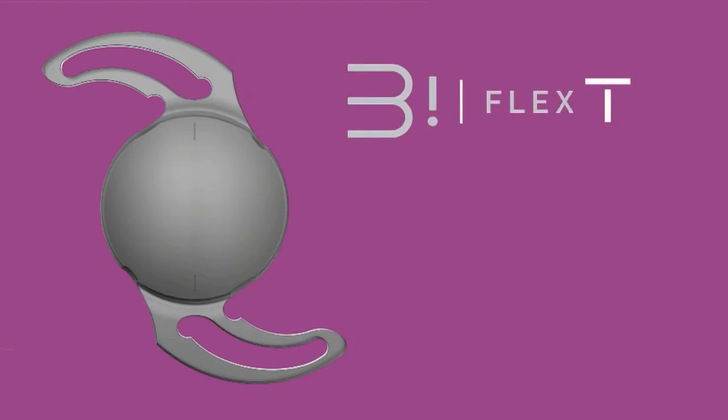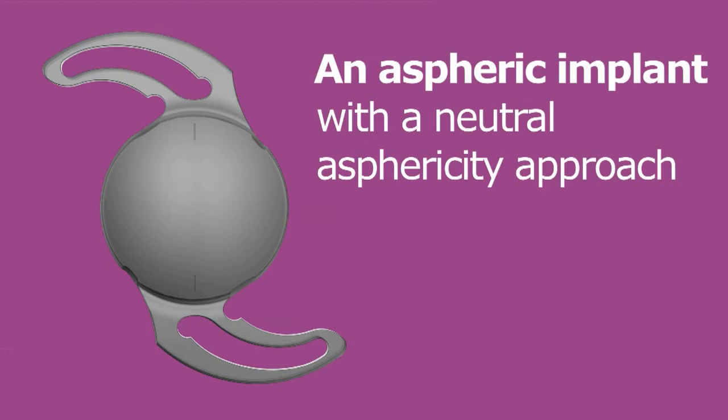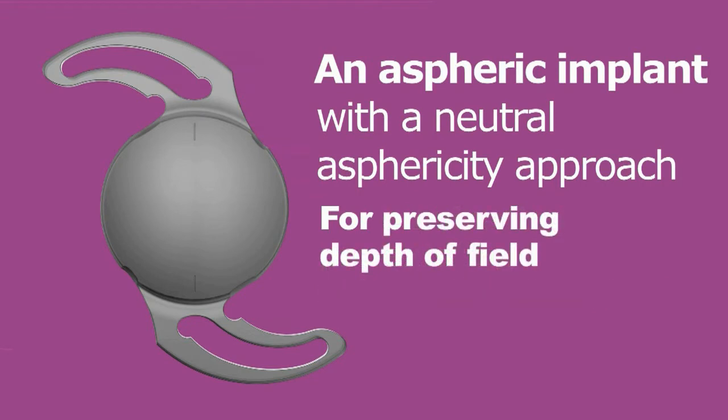In addition to an excellent toric correction, the Biflex Toric Aspheric IOL benefits from the general advantages presented by the Biflex platform. A neutral asphericity approach for eliminating the pre-existing spherical aberration of the crystalline lens and for preserving some depth of field by leaving the physiological corneal aberration untouched.